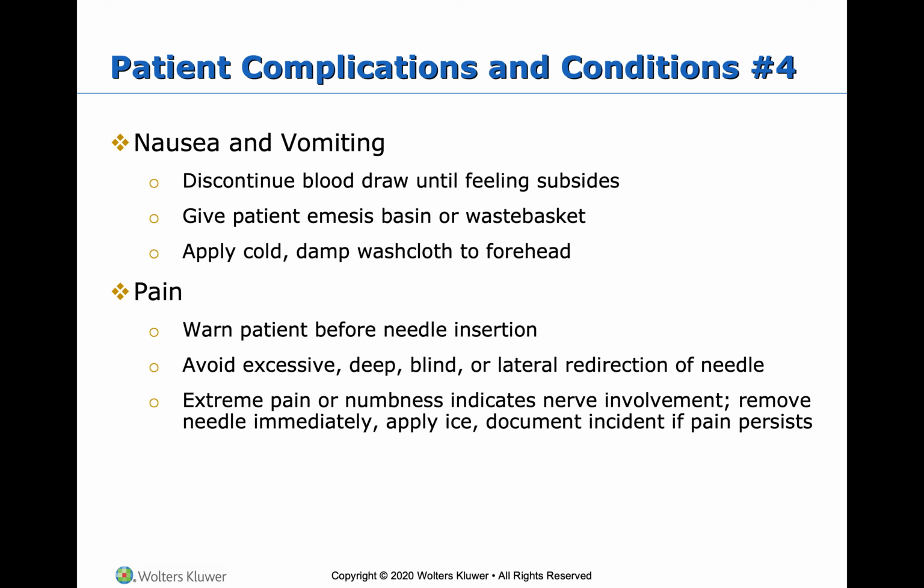Okay, so extreme pain or numbness: if they say that their hand is going numb or their arm is going numb, immediately remove the needle, get ice, and if the pain persists, document the incident and let your supervisor know. I've never heard of anyone hitting a nerve, but I know it is possible. I've had outpatients come in and tell me about nerve involvement with previous blood draws. As long as you're following your procedures for your draw, then that shouldn't happen. But keep that in mind.